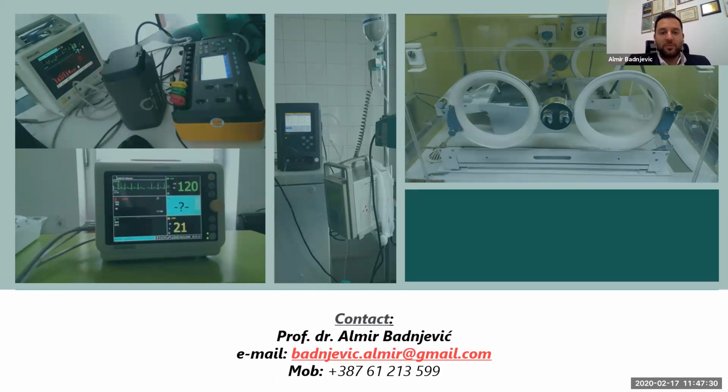But when you are doing, for example, routine maintenance, your sensors, which are already on that device, give you information by measuring some currents, voltages, resistance, etc., about your device. So the difference is that you are taking another outside device, which is called an etalon, which is calibrated, et cetera, and you are measuring the outside parameters. In fact, the parameters which are the most important for the patient.